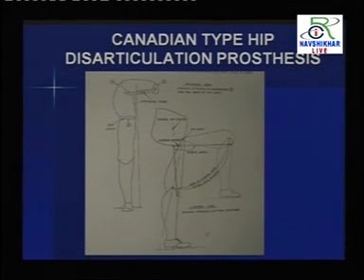But the main target is that we need a function out of the prosthesis which can help the disabled person, the person who has lost the leg. उसके लिए पूरा functions उसको नॉर्मल मिल जाए करके. तो इसलिए ये सब प्रोस्थेसिस जो हम लोग बनाते हैं, basically we want that the person should have mobility, ambulation should become easy, walking should be good, and should be able to perform his own life or her own life, जैसा जैसा उनका होगा, they can manage with the prosthesis itself. But this prosthesis is most complicated.